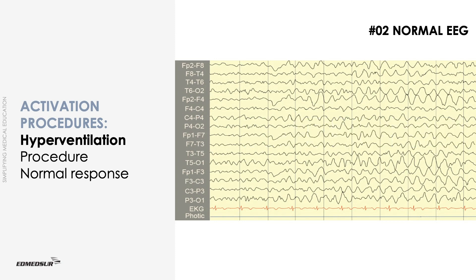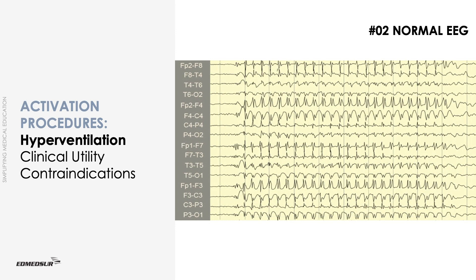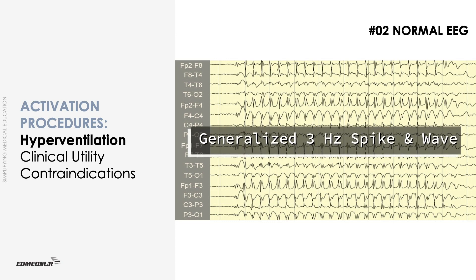Hyperventilation responses are age-dependent. They are most pronounced in children and teenagers. Hyperventilation is considered the most powerful activation procedure to elicit absence seizures, or, as this EEG shows, generalized 3 Hz spike and wave discharges.